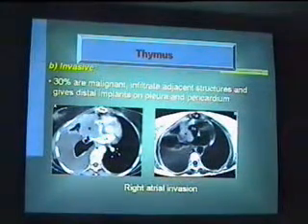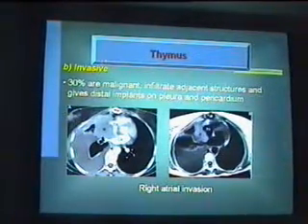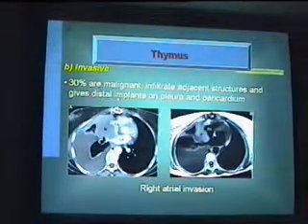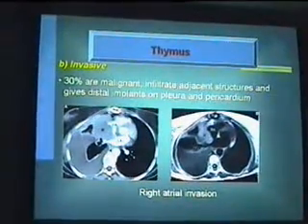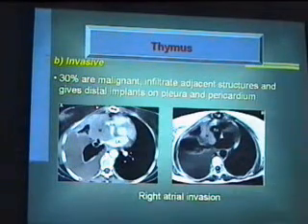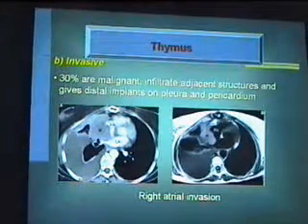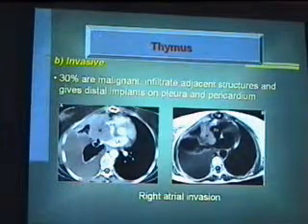الانفيزيف يعني ايه؟ الانفيزيف يعني it invades other structure من اسمها. 30% من الانفيزيف ثايموما is malignant and infiltrates adjacent structures giving distal implants. والامبلانتس الشهيره قوي بتاعت الانفيزيف ثايموما بتبقى في البلورا وبتبقى في البيريكارديوم، وبلاقيها حوالين اللنج، يعني soft tissue masses around the lung with a mediastinal mass. لما الاقي الاثنين دول مع بعض افكر في ثايموما.